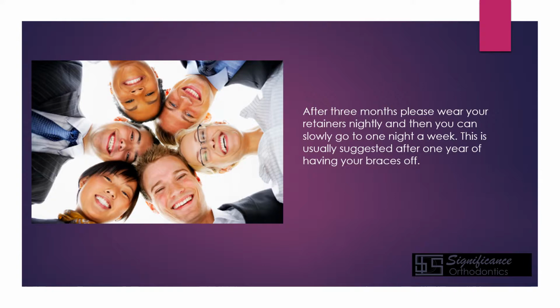Okay, so after that year, the anniversary date of getting your braces off, so 1 year from today, you can start backing off from your retainers, maybe skip a couple nights, skip 3 nights slowly. But again, at least 1 night a week for the rest of your life, you need to wear your retainers.